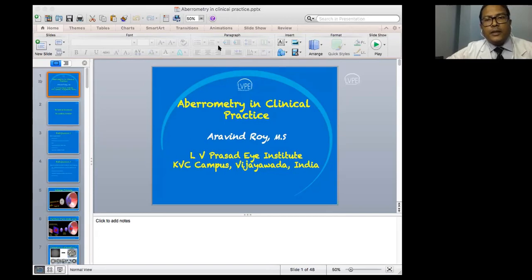The other question that one of our viewers has asked is, is the Zernike pyramid useful? Yes, the Zernike pyramid is commonly used. It is helpful for researchers to discuss with each other the degree of aberrations that are there. It is useful to communicate with the patient and graphically present what kind of aberrations are there as a component of the total aberrations of the eye. And mostly the coma and the higher order aberrations are important visually.